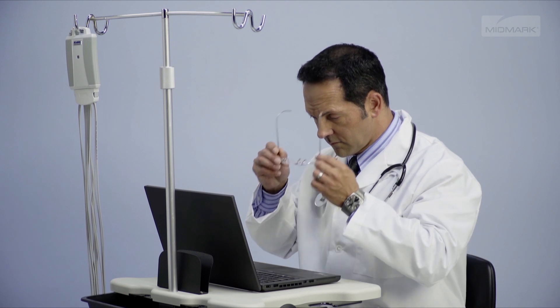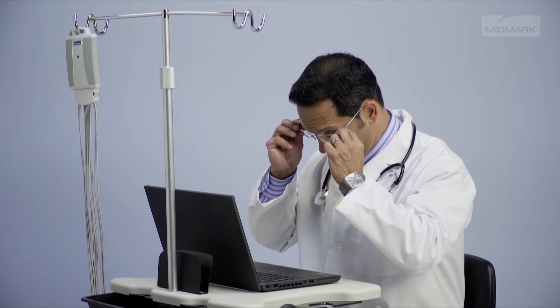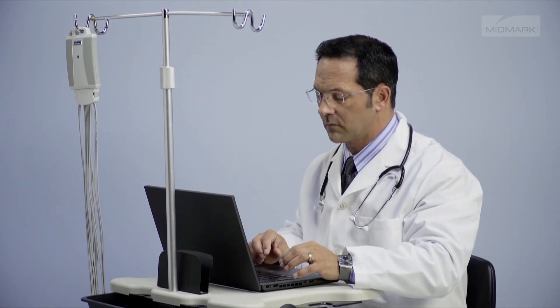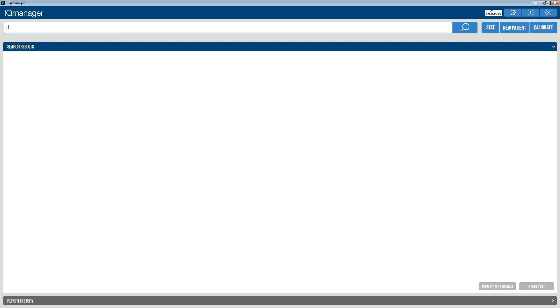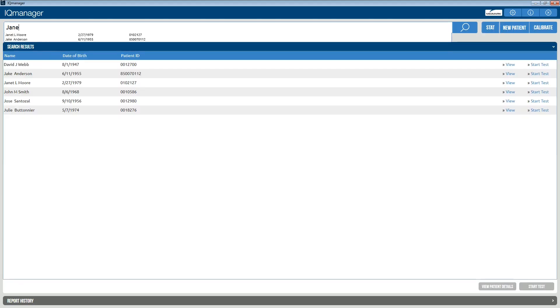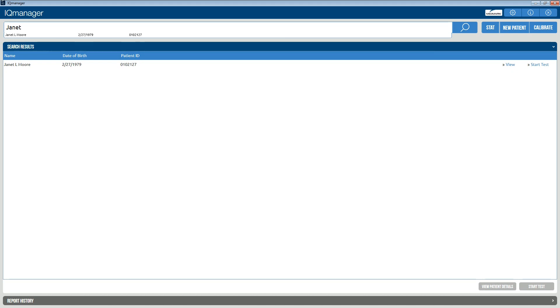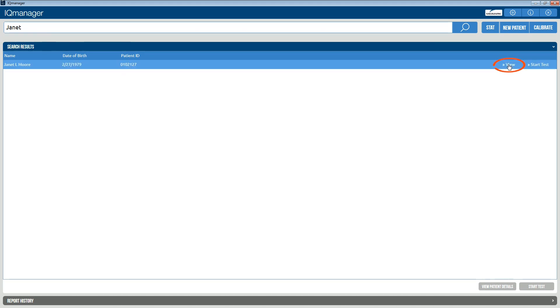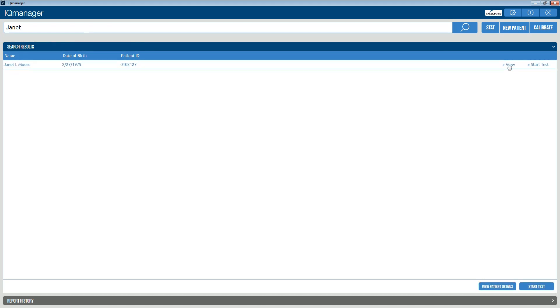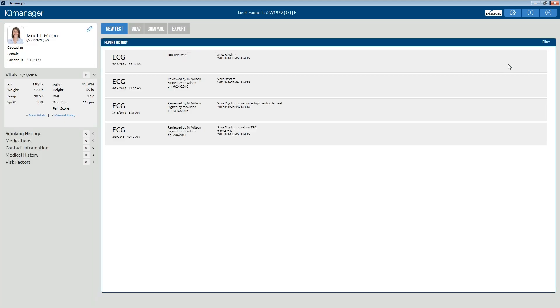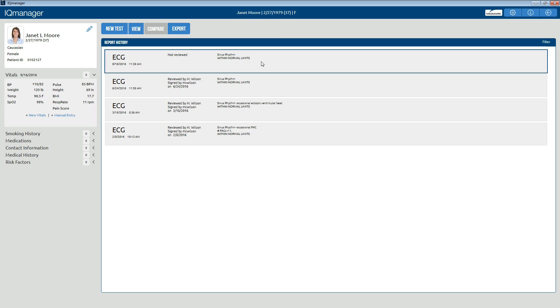To retrieve an ECG report for review, enter and search by the patient's name or ID on the Midmark IQ Manager opening screen. Click View next to the patient to review the patient data and a list of tests for the patient. Then select the resting ECG report you want to review and click the View button.